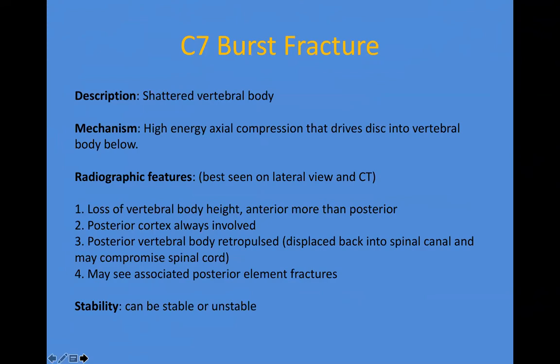One term is discussing the mechanism of where the force came from. The other term, the term axial loading versus flexion versus extension, is the way that we describe the person's position of their neck and the way the force came on the cervical spine during the injury. When we say burst fracture, that is a description of what we see radiographically in the vertebral body after the injury.